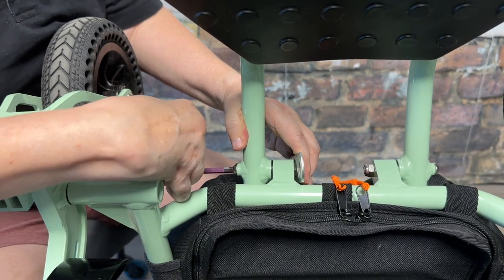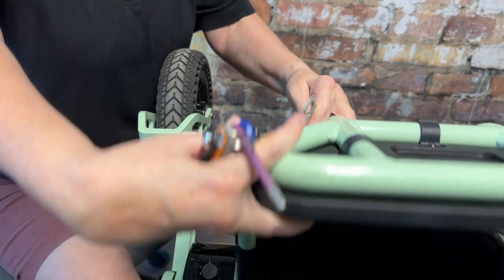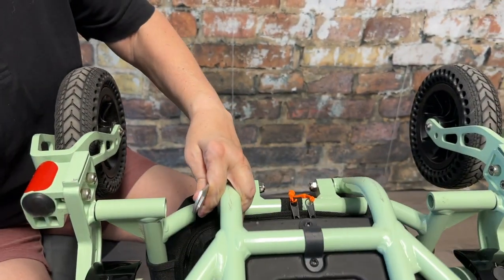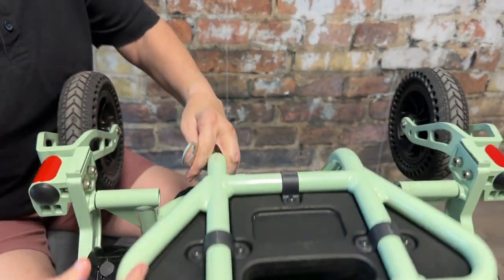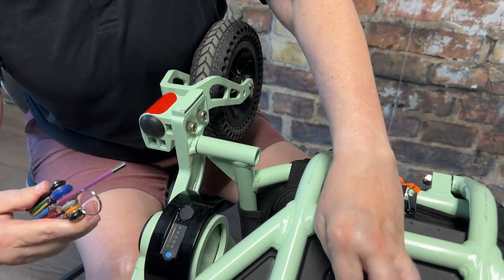Once this is tight, you will notice that the foot rest will be able to fold and unfold with more resistance. If you cannot get it tight, there may be broken washers inside those two bolts.